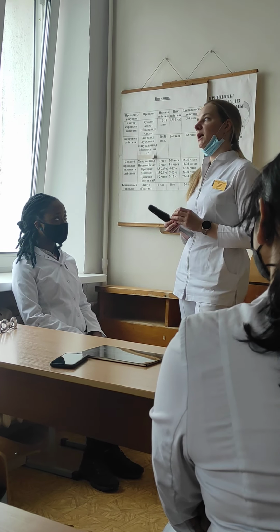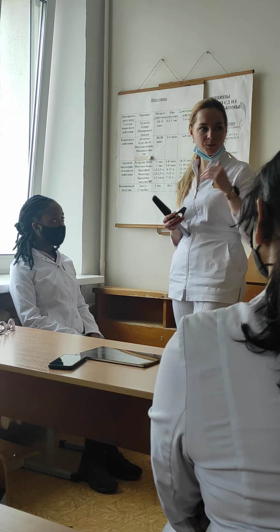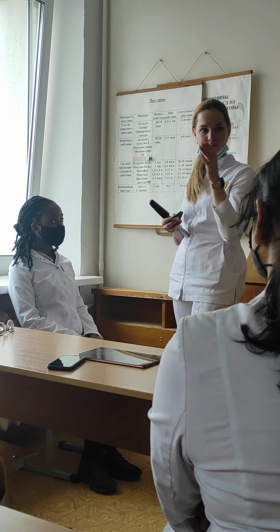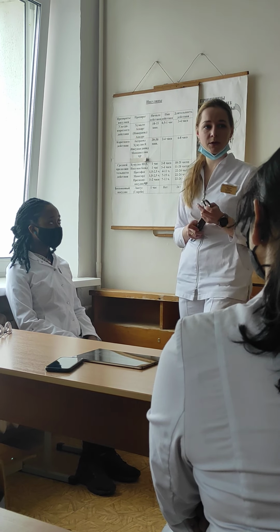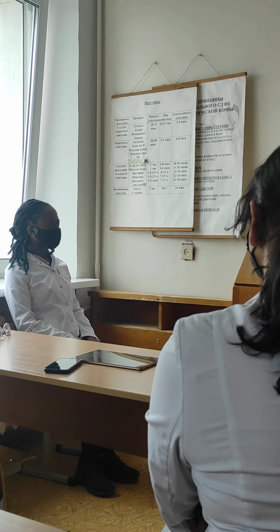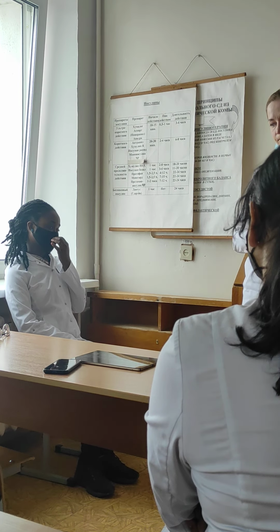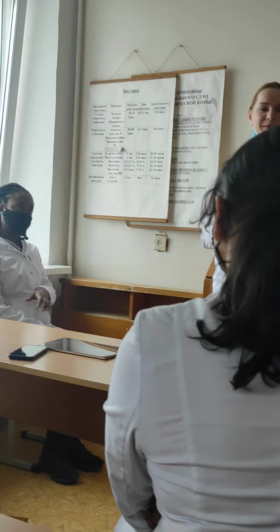I have a presentation. There is a description of the normal eye fundus. You will have time to read it again and check the picture before the practical skill exam, because you will be needed to do this exam. To do this examination is actually hard. It takes maybe 6 months to have the skill to do ophthalmoscopy, especially with the mirror ophthalmoscope.